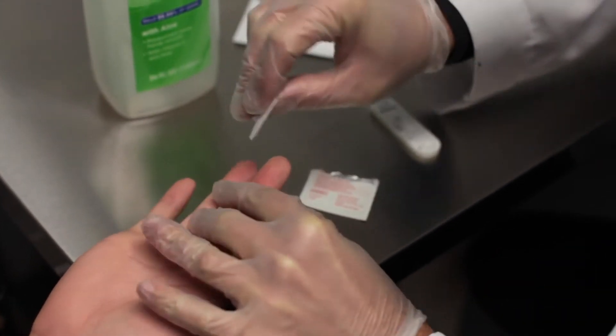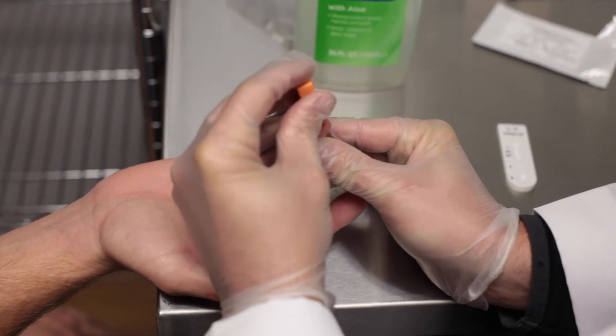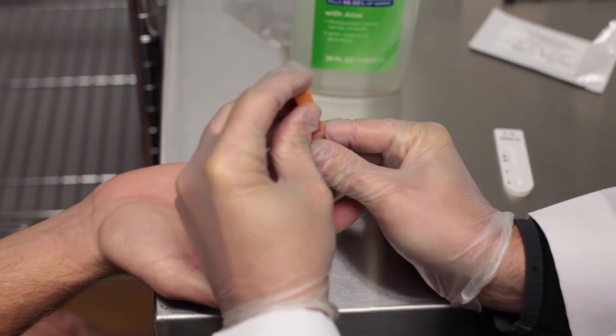Next, disinfect the patient's fingertip with an alcohol swab. Push the sterile lancet firmly onto the chosen finger.